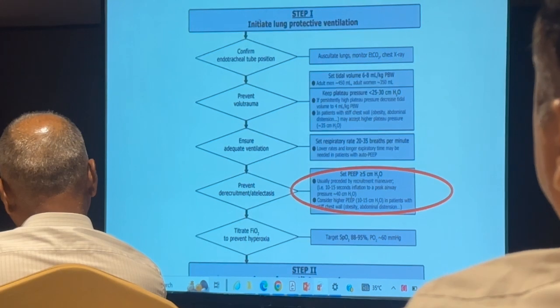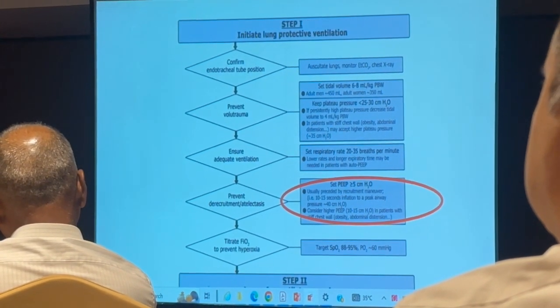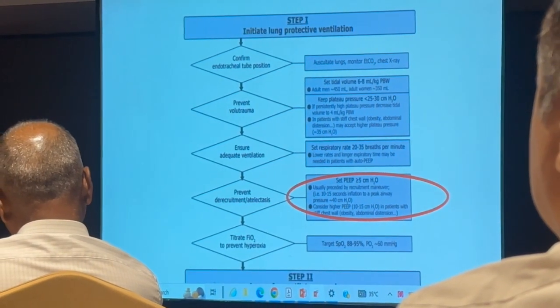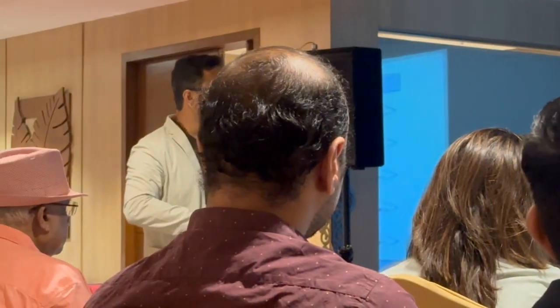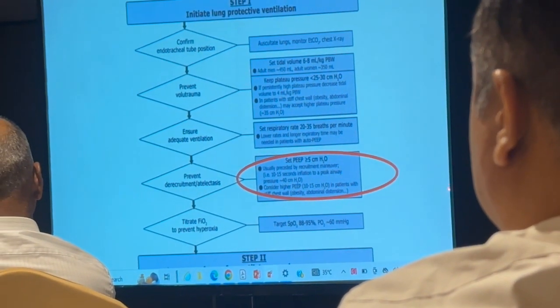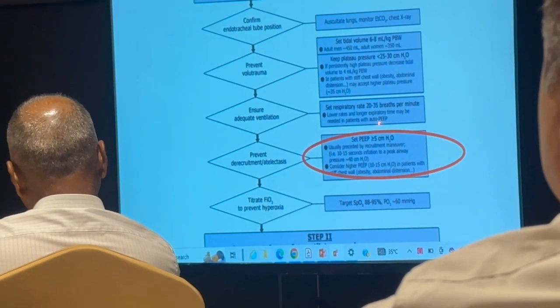Rate has to be adjusted as per the time constant. If you feel that the patient is having air trapping, they have to be given more expiratory time, so you have to reduce the rate. In case there's no air trapping, you have to increase the minute ventilation for the dead space which is open. And you have to set the PEEP always and always more than 5, because you have to take care of the recruitment of the lung. No use below 5. Permissive hypoxemia, 88 to 95. I don't know why people keep more than 96, 98 in their ICU. Everybody loves it. But somehow 88 is a magical figure now.